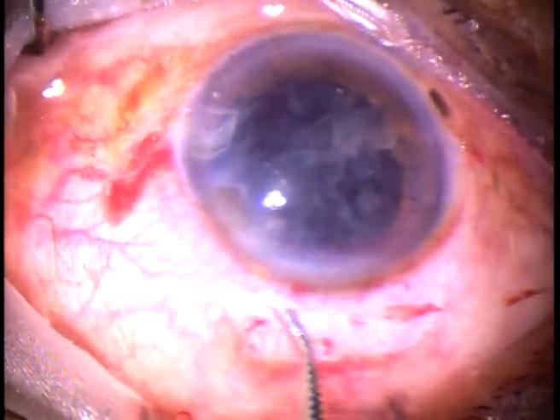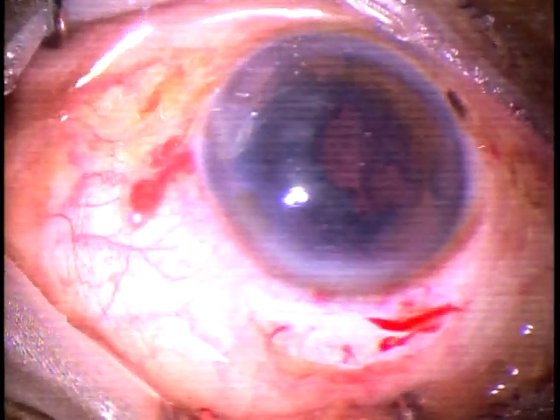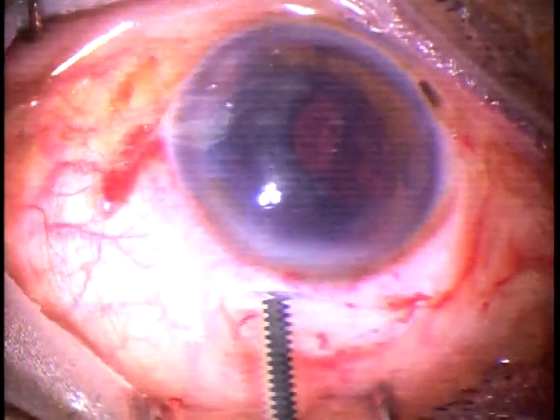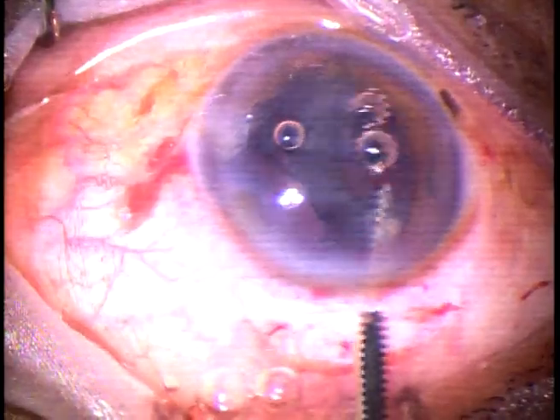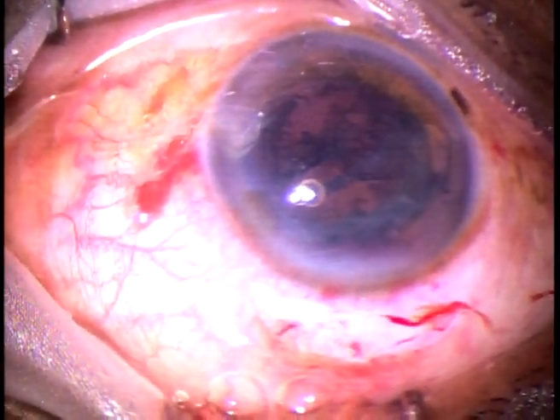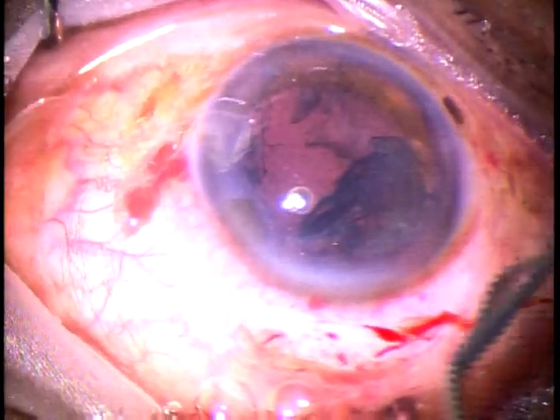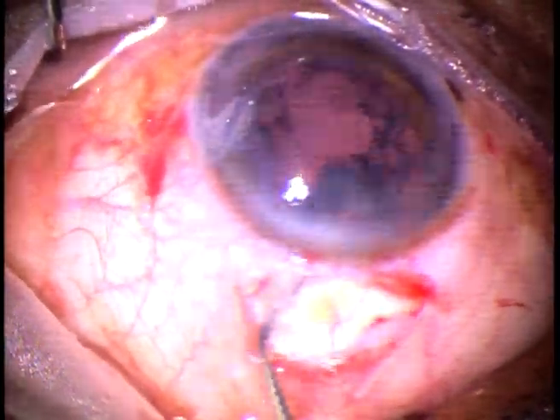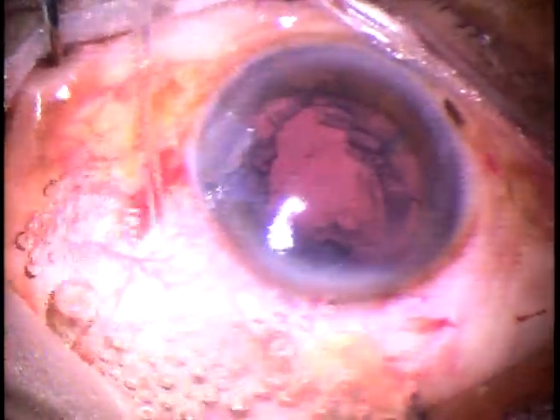BSS is irrigated and a big chunk of epinucleus has come out. Attempting removal with a Simcoe by depressing the posterior lip of the main wound, but it didn't come out. When it doesn't come out, there is a sure-shot technique: inject viscoelastic through the side port at 6 o'clock, then some visco on either side of the epinucleus mass, then just depress the posterior leaf and it comes out. We can call it visco-expression of epinucleus.